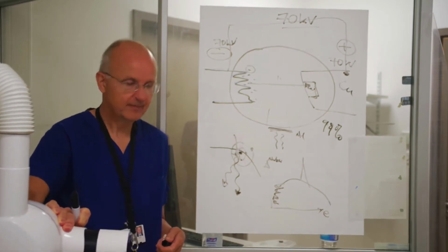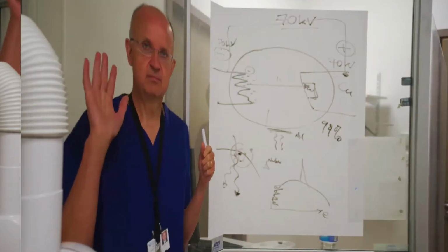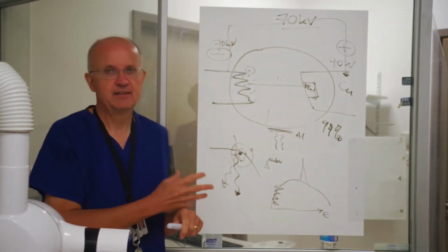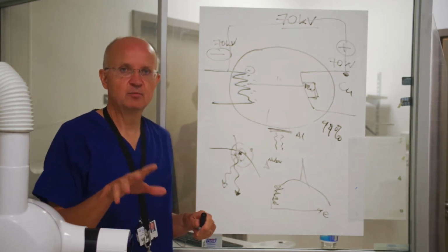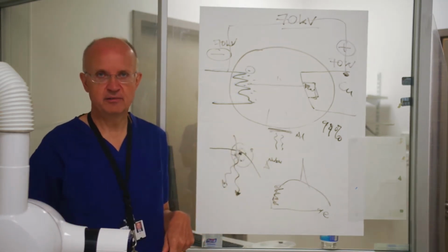Okay, so let's just think a minute about the controls that we have within the X-ray tube. Now that we've refreshed our memories in terms of what's happening within the X-ray tube, and so file that away for future laters, we're getting to the important thing now, which is how do we control what is happening in the X-ray tube and what effect does that have on our image?